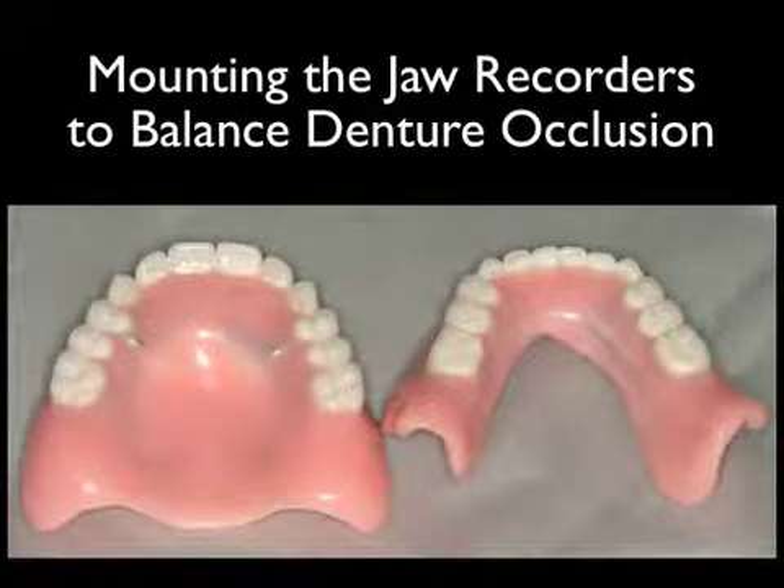In this case, we are going to demonstrate how to mount the jaw recorders to balance denture occlusion.